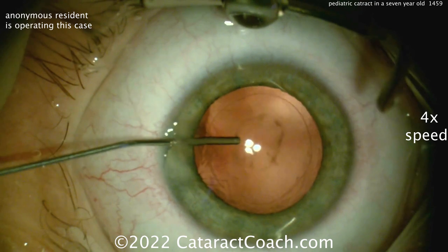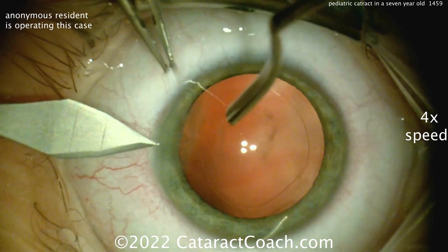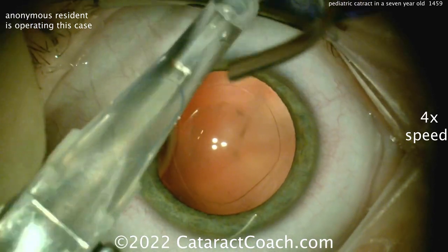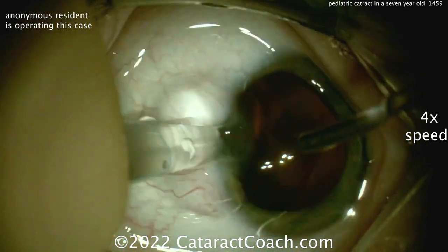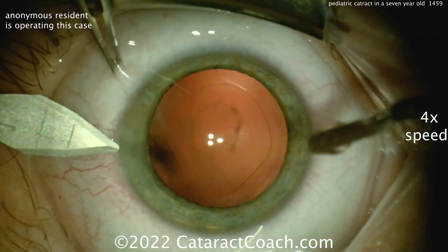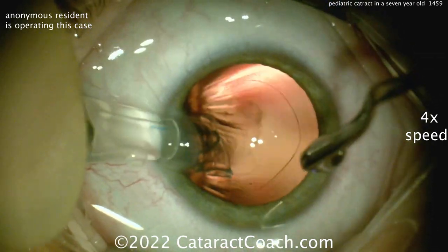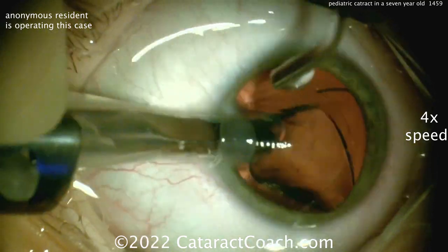Now putting in the viscoelastic. It looks like the lens is going to go right in the capsule bag. You can also put the IOL in the bag and do the posterior capsulorhexis under the optic while the optic is already in the eye. Here comes the lens — it looks like a three-piece acrylic lens. The incision was slightly enlarged; you want to make the incision an appropriate size. And again, there's no bleeding from the incision — I'd rather have a little bit of bleeding next time. This incision is certainly going to be getting a suture.